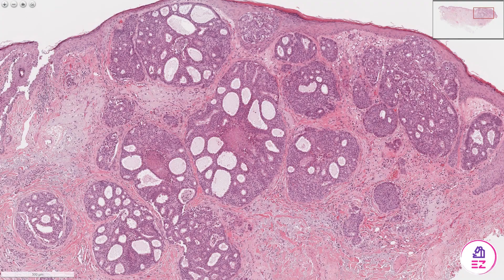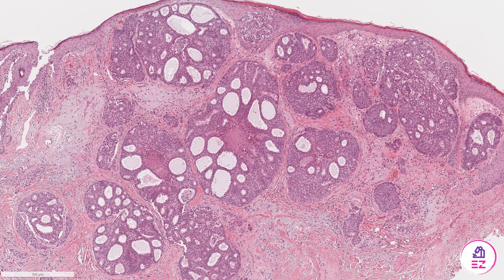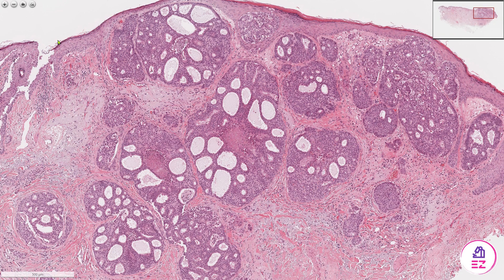Hello and welcome to Path Made Easy. Today's example is a salivary duct carcinoma. This particular example is a metastasis to the skin, hence why you're seeing the epidermis covering this biopsy, but the morphology is the same regardless of whether it's in the skin or in the parotid gland or somewhere similar.